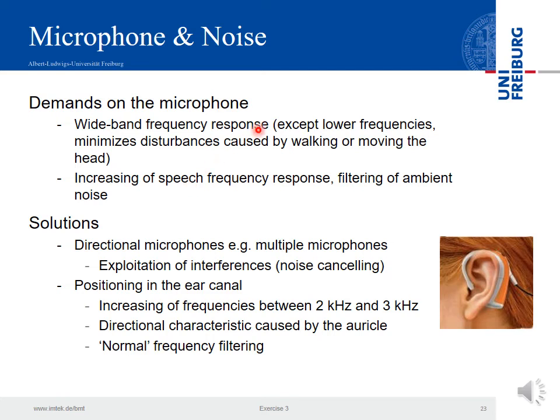You want to increase the speech frequency responses and filter ambient noise, and you can imagine having children, males, females with different pitches, with different tones, so this is quite challenging, and even more challenging is to focus on speech.